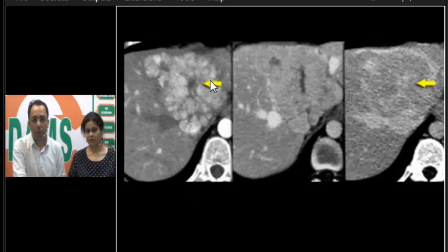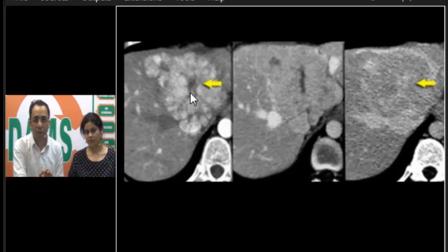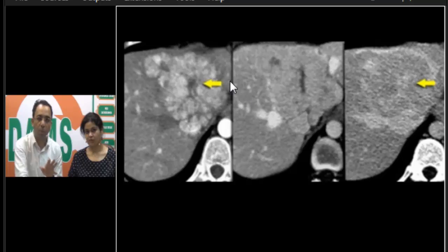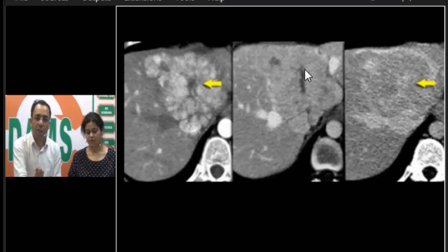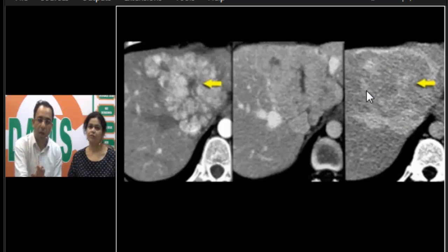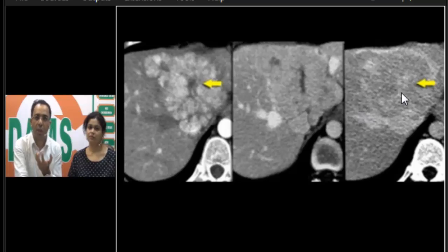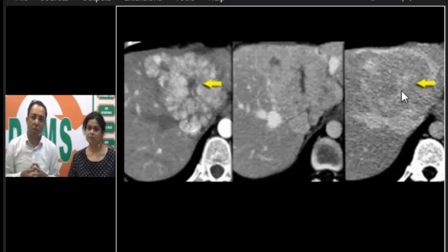You can see a well-demarcated lesion with no evident capsule and no calcification. There is a well-defined central scar with fibrous septae going into the lesion — very typical of FNH. The lesion becomes isodense to the liver in the portal venous phase, and again isodense in the delayed scan, but the scar becomes hyperdense — it enhances in the delayed phase. These are the typical characteristics of FNH on triple-phase CT.